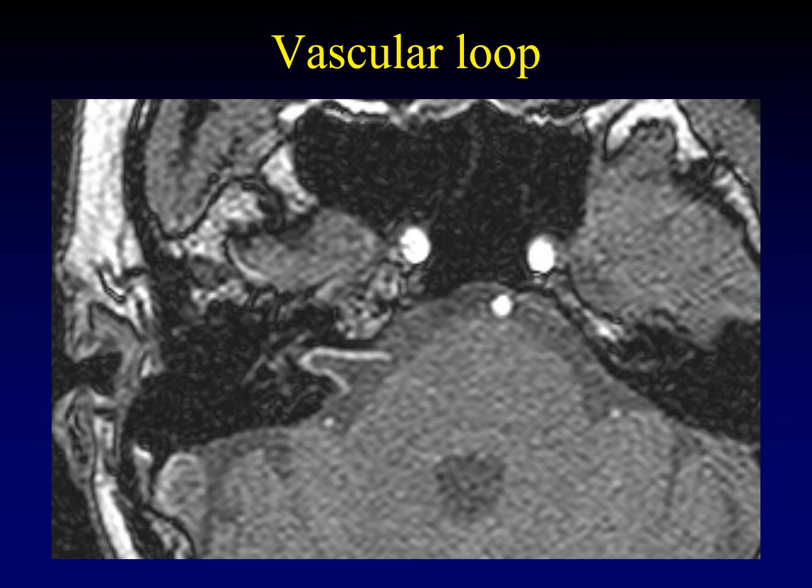Here's another example of a vascular loop that can affect the internal auditory canal. At first glance, you have a dural lining, enhancing dura, lining the inside of the IAC. Maybe this is a thin meningioma, or maybe this is some sort of leptomeningeal enhancement, carcinomatosis, something like that. This is a normal bit of anatomy. The anterior inferior cerebellar artery often loops into the internal auditory canal, crossing the porus acousticus. In fact, 30% of patients have an AICA loop that extends into the internal auditory canal.